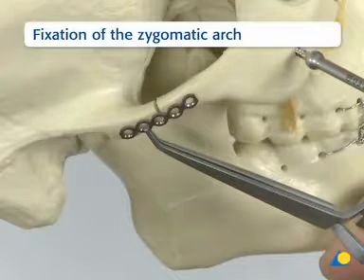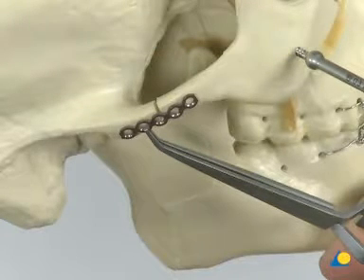The next step is fixation of the zygomatic arch, which is essential to establish the correct anterior-posterior projection and the width of the face. A straight 5-hole, 0.7 mm thick adaption plate is selected when there is only one fracture through the arch. If the zygomatic arch fracture is comminuted, it would require a longer plate to span all the fracture fragments. Due to the anatomical form of the arch, it is usually not necessary to pre-bend the plate.